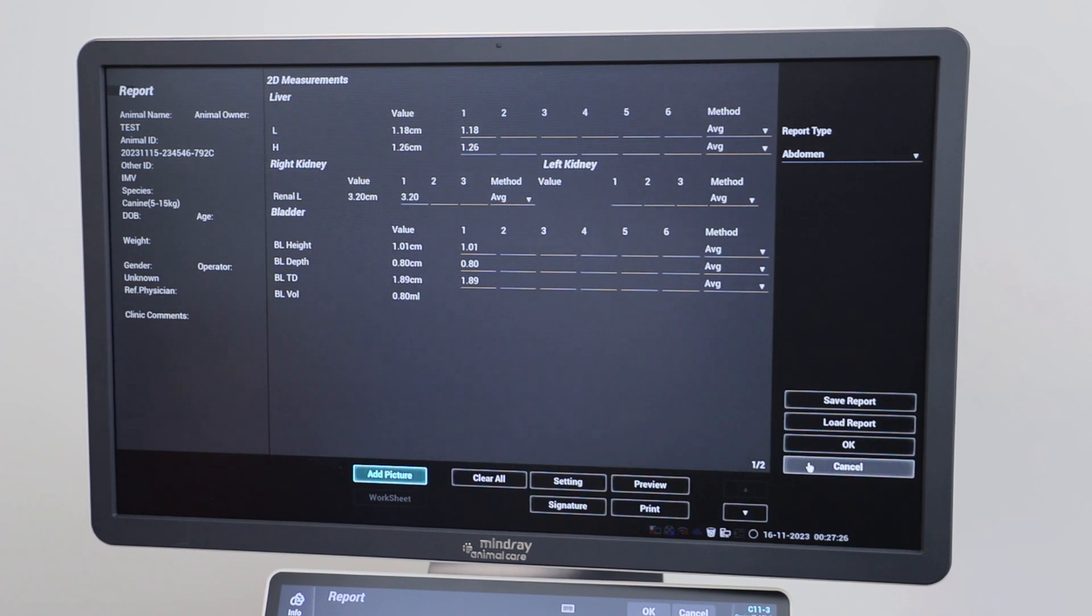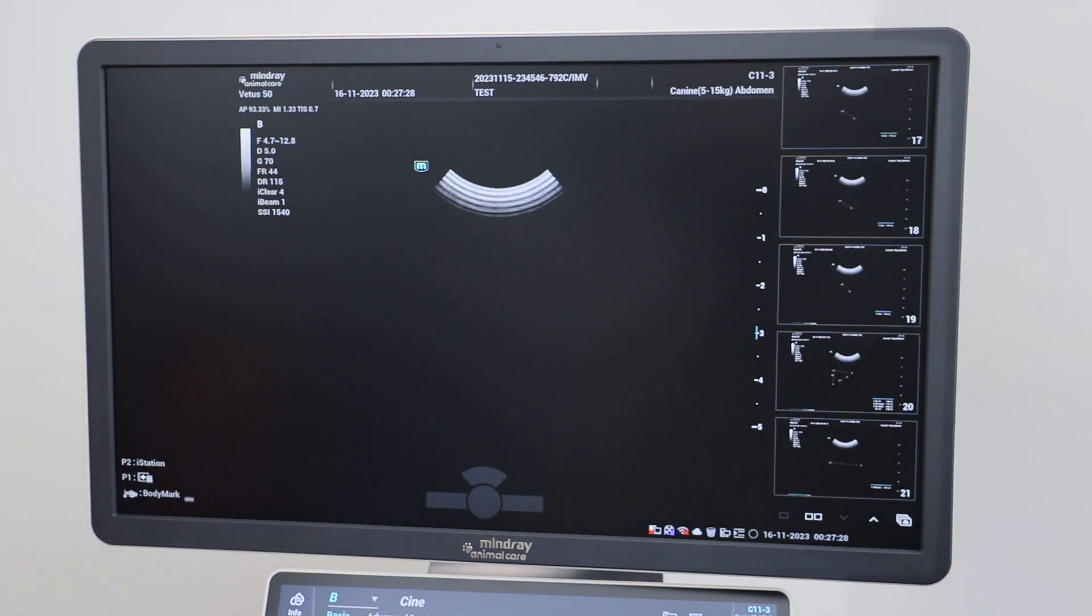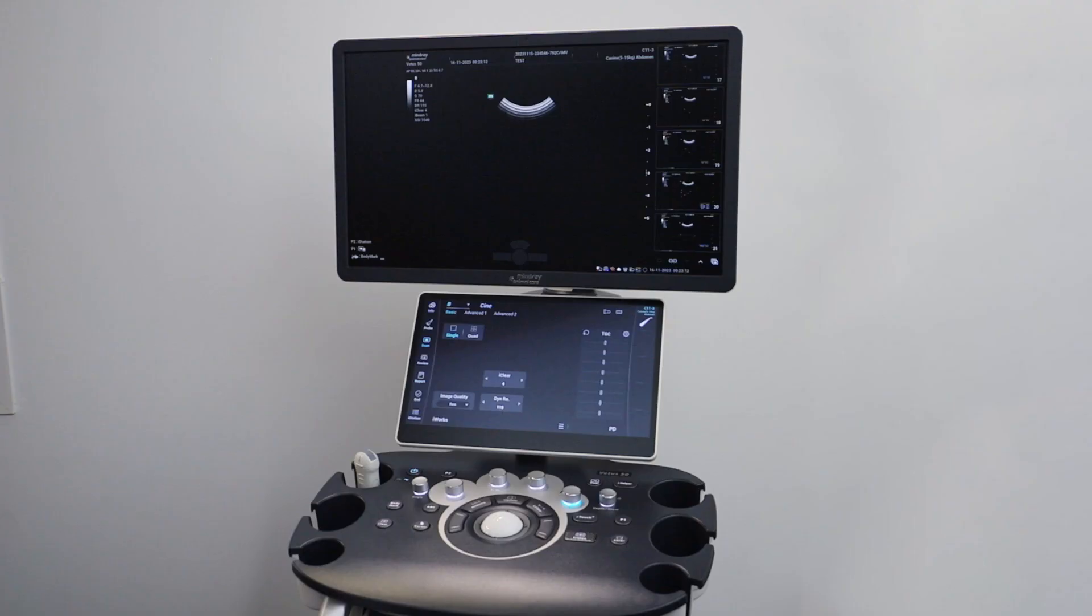To come out of the report function, just click cancel and you will be taken back to your live scanning screen.